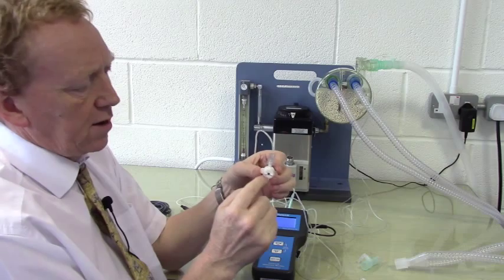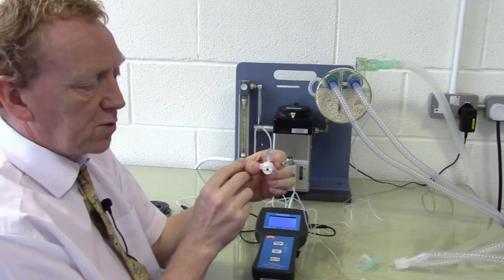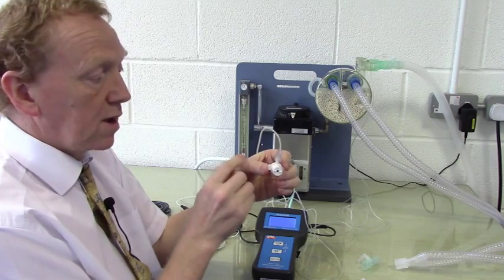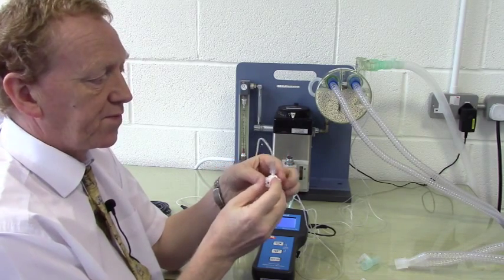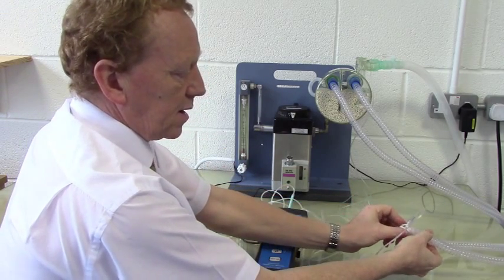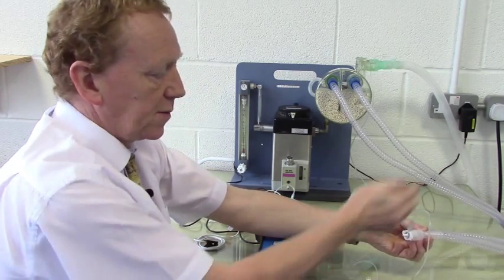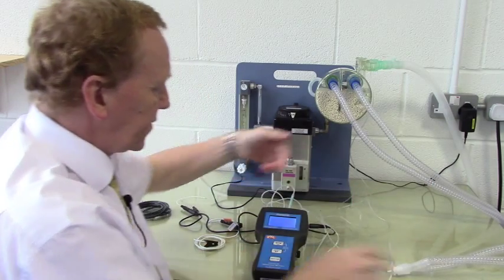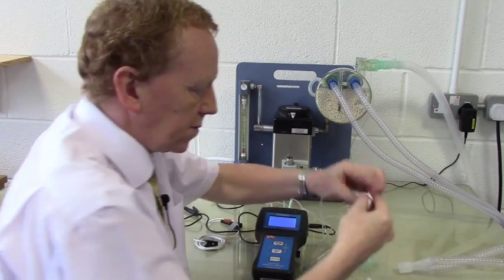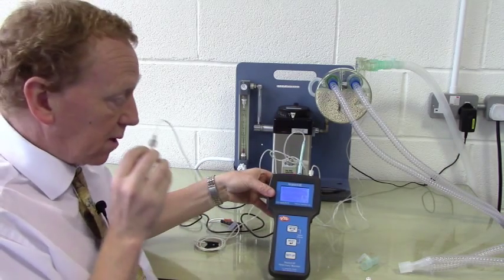You'll notice that this has a filled in area here. This is called a low dead space connector, and these are much more suitable for sampling capnographs in animals less than about a kilo, as the low dead space improves the quality of the waveform. Again, when used in circuit, this is placed at the end of the anaesthetic circuit like that, and your endotracheal tube will be placed here, sampling uphill into the animal and then off to the waste where it's removed. This setup provides very nice waveforms in small animals, and it is suitable for larger animals too.